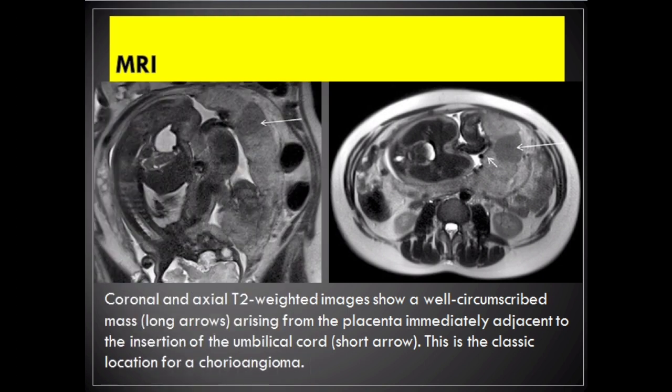Coronal and axial T2-weighted images show a well-circumscribed mass (long arrows) arising from the placenta immediately adjacent to the insertion of the umbilical cord (short arrow). This is the classic location for a chorioangioma.